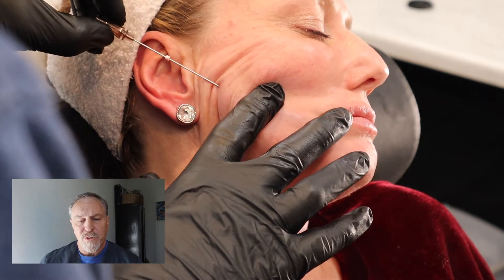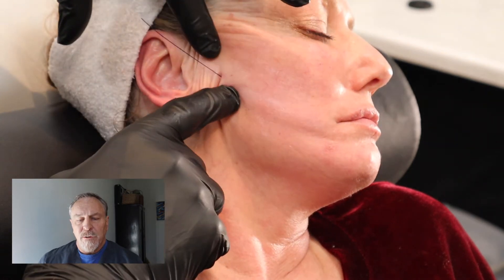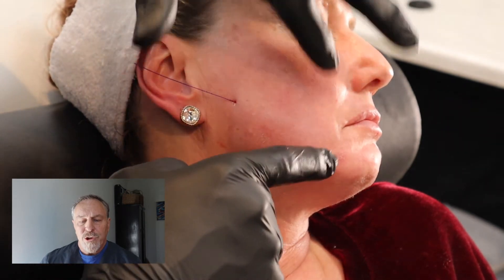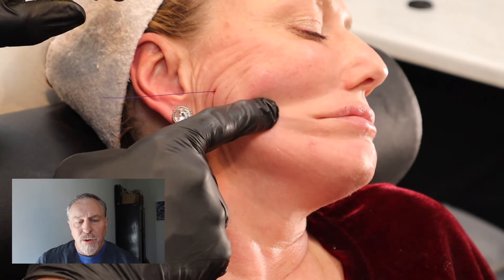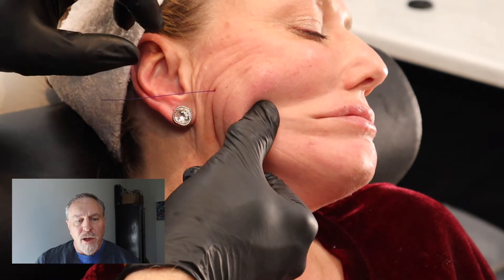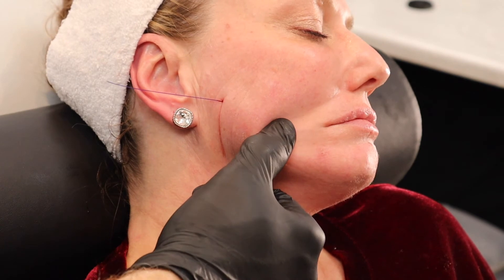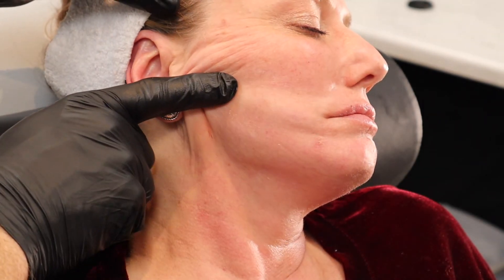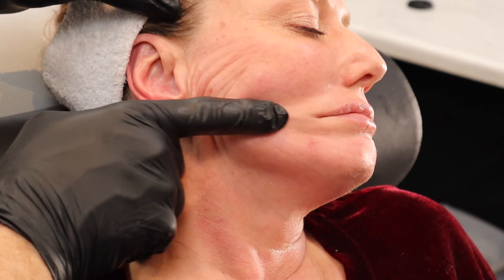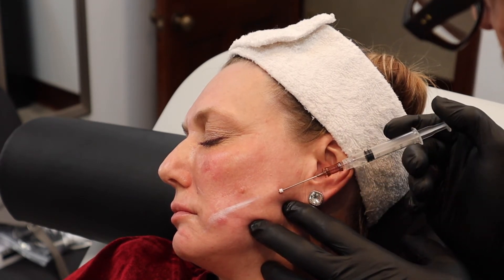The barbs engage on the dermis and produce an immediate retraction. This is on the right side — we're pulling back on the jowl, a little bit of a dropped lower cheek just above the mandible. As you feel it, you can feel this ratcheting up as those tiny barbs engage that are etched into the thread. The thread is then clipped with iris scissors at the level of the skin, and it will retract under the dermis so nothing is going to be sticking out after you're done.